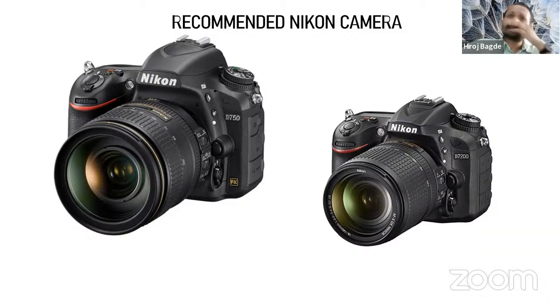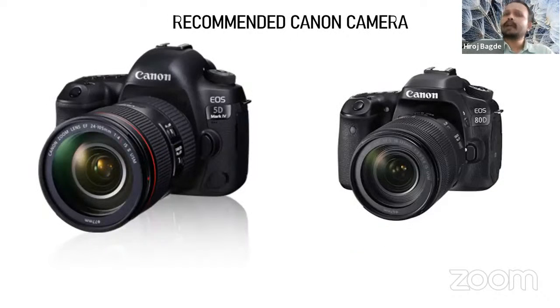So my recommendation is the D750 for a Nikon full frame, and the D7200 or any type of 7000 series in Nikon for a crop sensor camera. For Canon recommendations, I am very much aware that many Canon cameras have come. The 5D series Mark for Canon as full frame, and for a crop sensor, start off with the 80D, which is the minimum for us to start off with dental photography.